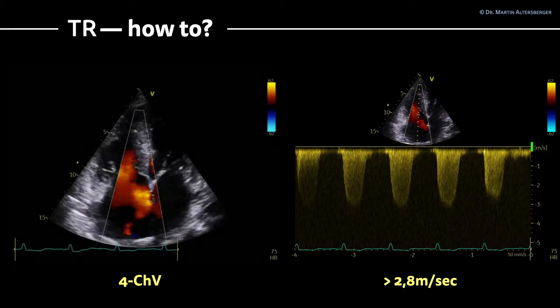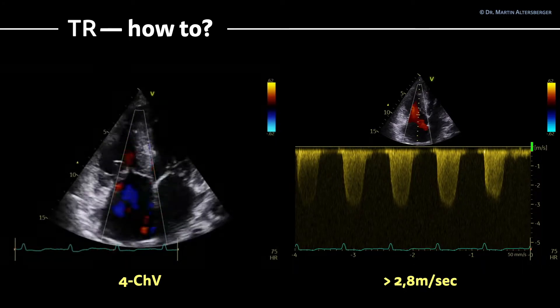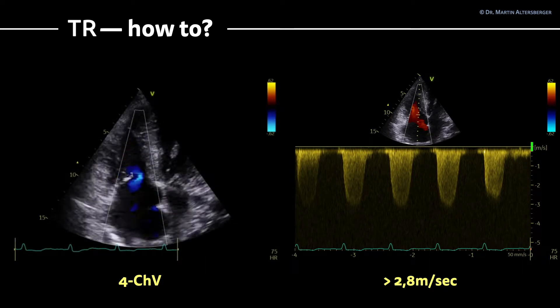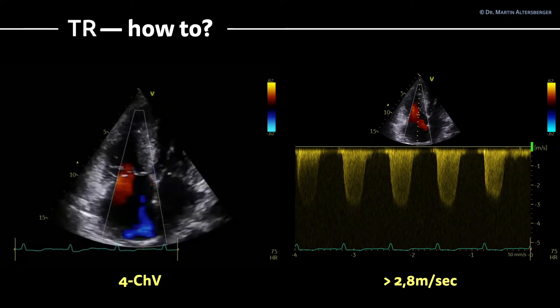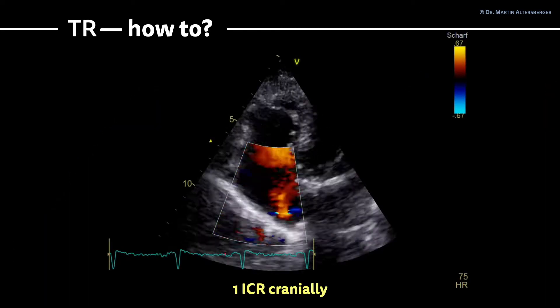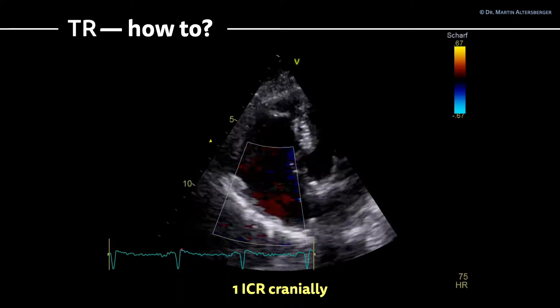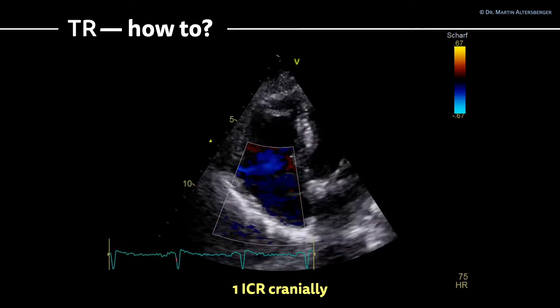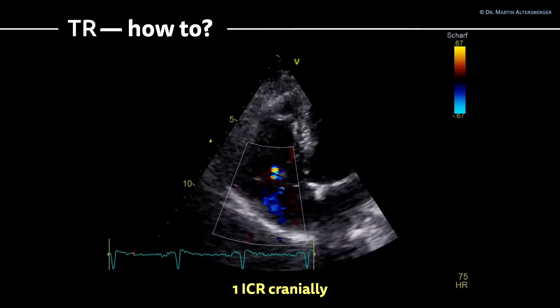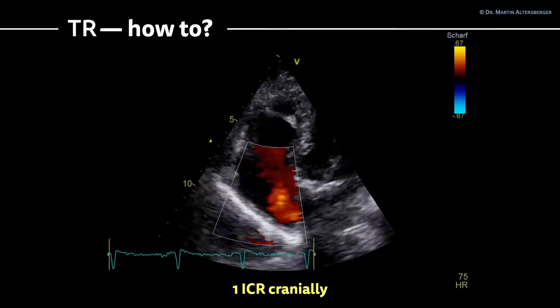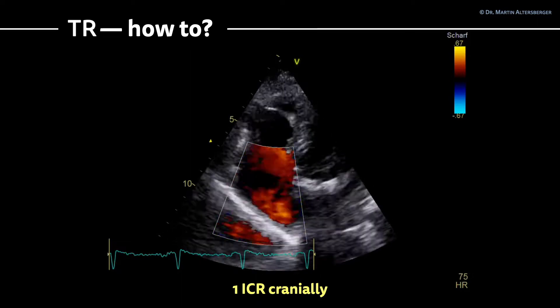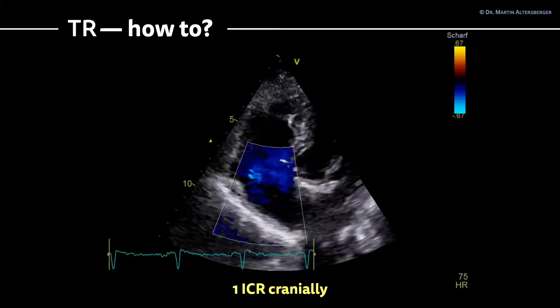If you cannot measure it in a four-chamber view with a focused view of the right ventricle, you can simply move one intercostal space more cranially. Very often a more cranial approach gives you a better angulation towards the TR signal. If you have a normal focused right ventricular four-chamber view and cannot measure a TR signal, move one intercostal space more cranially and you will see the TR signal nicely.